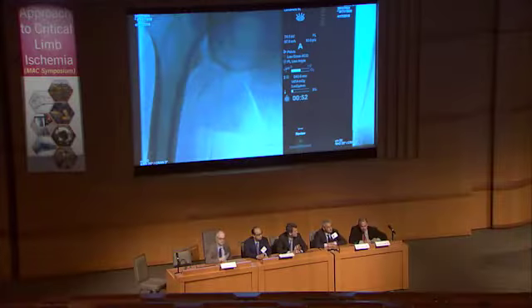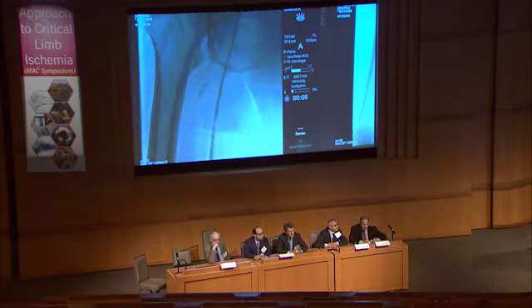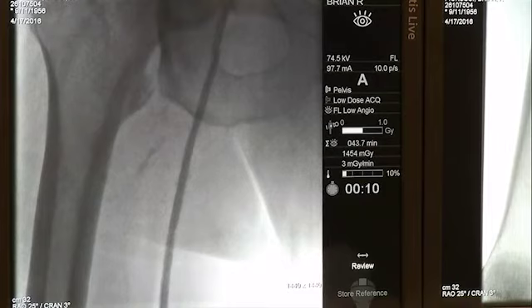So, Manny, did your balloon fully inflate there? The picture's off of the balloon? Yes, it did. Good. It actually did, and this is a 6.0, Dr. Walker. So great. The balloon inflated nicely there and is inflating nicely here. Nice. So I'm going to go down one more time and show you that part.